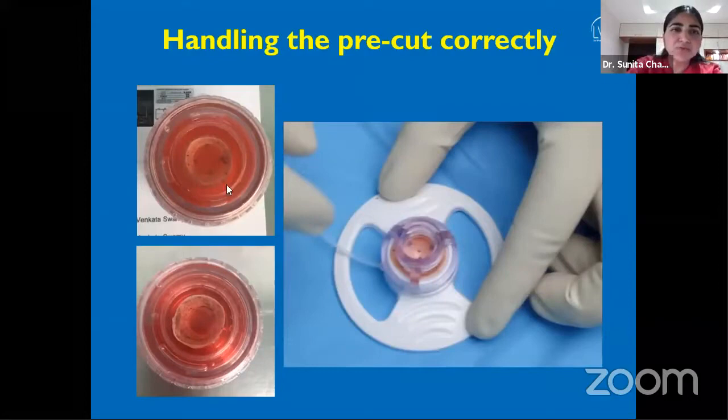Now, there will be a situation where you get the four orientation marks perfectly centered. And sometimes it may just so happen, especially if the graft preparation has been done a day prior or a few days ago, you may lose the marking or orientation mark. So it is important to identify where exactly is the center of the cornea, because a dissection with the Moria microkeratome is not up to the limbus. So we have to exactly pinpoint what the center of the dissection has been.